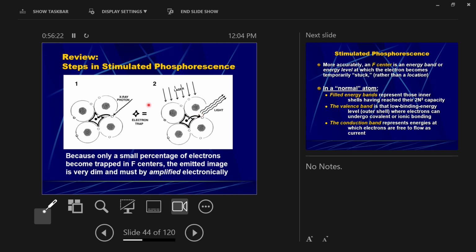So if this part on the plate got no X-ray exposure because there was a lead mat over it or something like that, or a metal piece in the body, then when the laser beam asks it how much light it's going to give, it's going to give none, because it was blocked. No energy got absorbed. But if it's like the black background on an image, that gets lots of exposure.